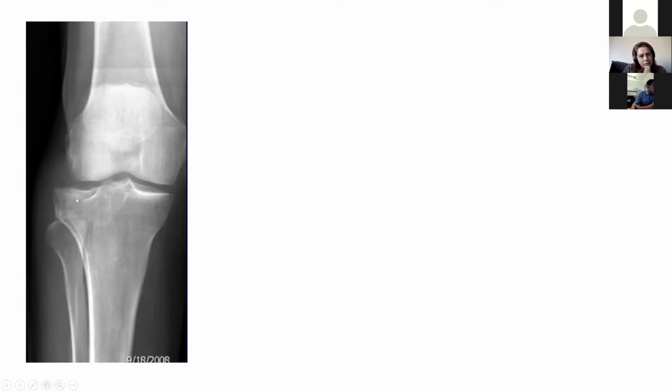Probably anterior. Yeah, probably anterior. The most common split depressions are anterior. And then this bit here, posterior, that's your intact lateral plateau. So the difference between that and that is your joint depression. What else do you notice in this lateral compartment? It's tough to see the metaphyseal exit point.